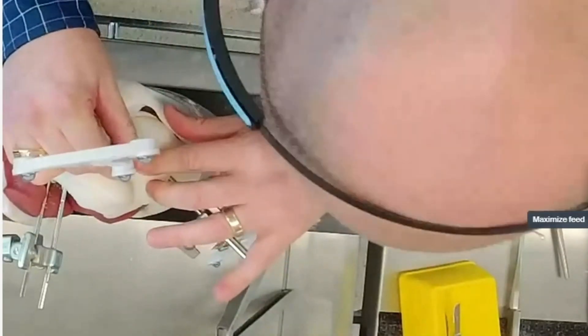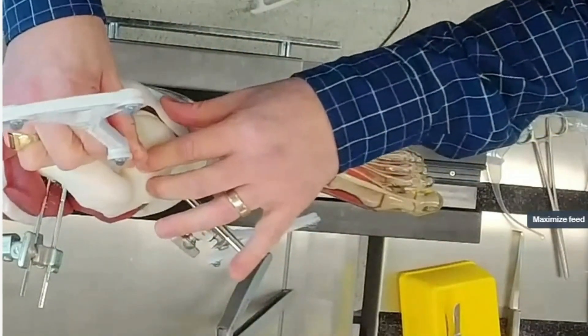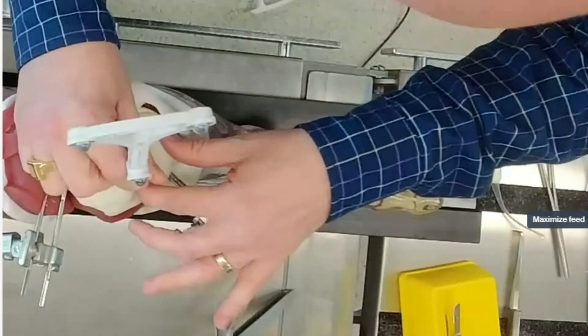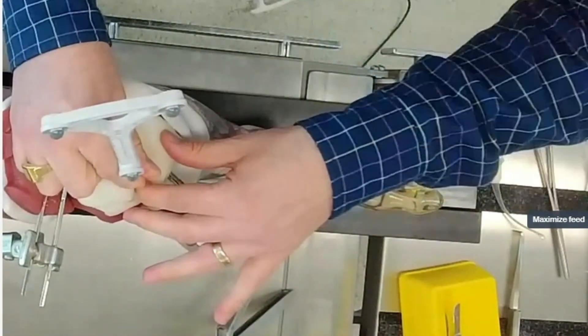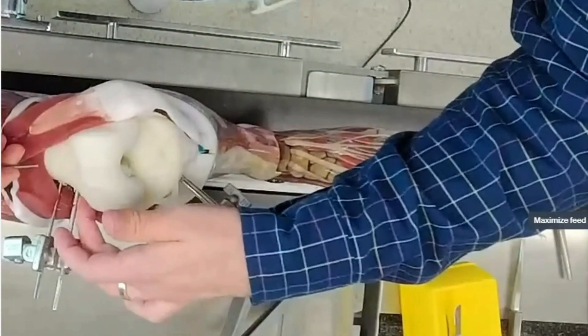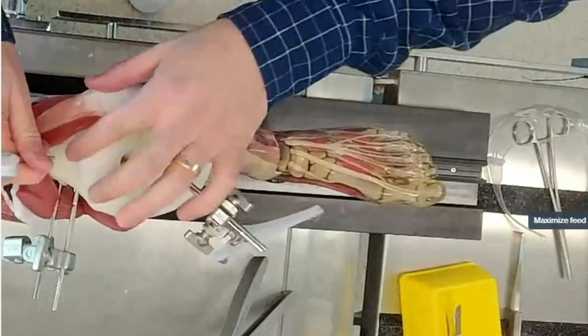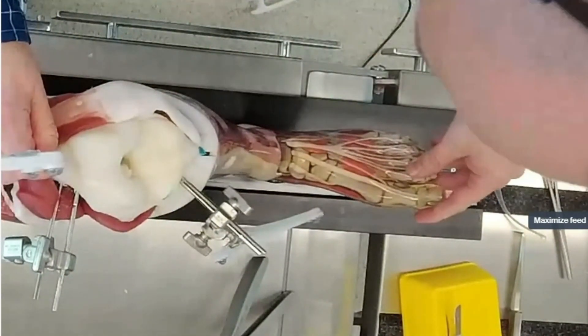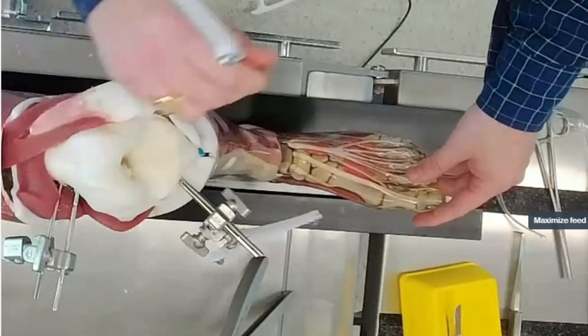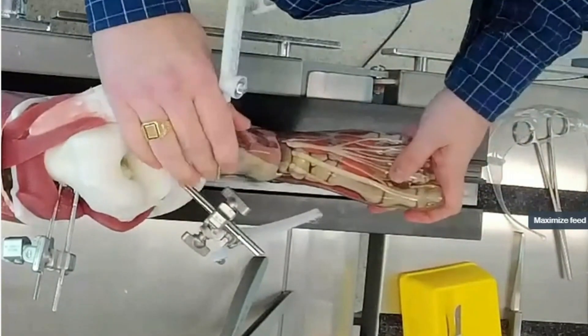All the anatomic landmarks are very different to a sawbone — they're very prominent and very visible, so it's actually quite straightforward and much more realistic. You also get a great feeling when putting these in as you go through the first cortices and then hit that posterior aspect of the posterior cortex — very lifelike, very realistic, simulating the bicortical fixation we're looking to achieve on those pins.